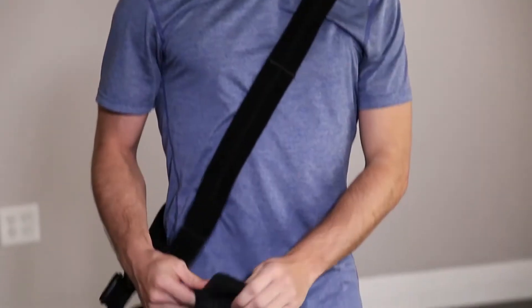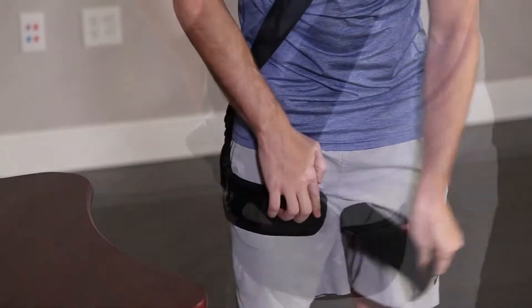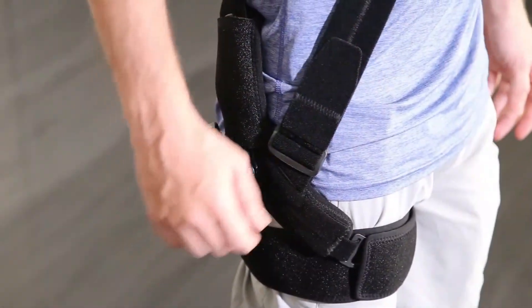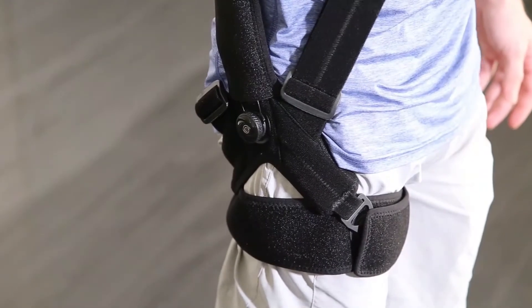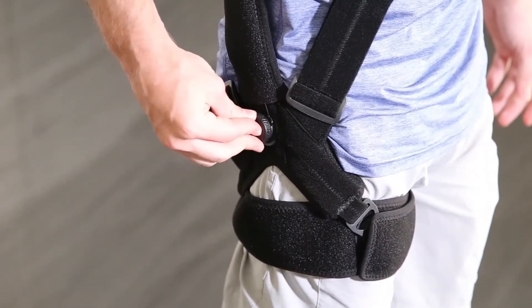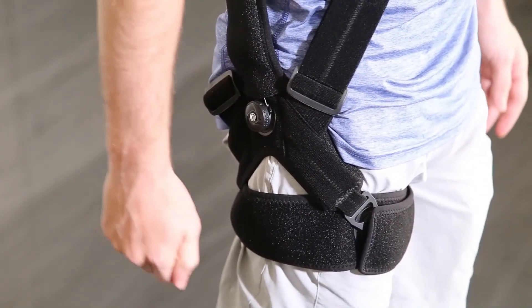Take the thigh strap, open it up, slide it around the thigh, and velcro it down. Then tighten the front strap of the harness, put in the tension dial, and tighten that down to the appropriate tension.